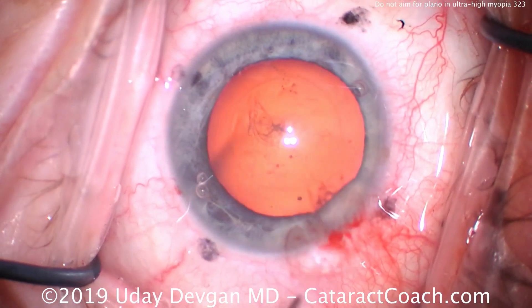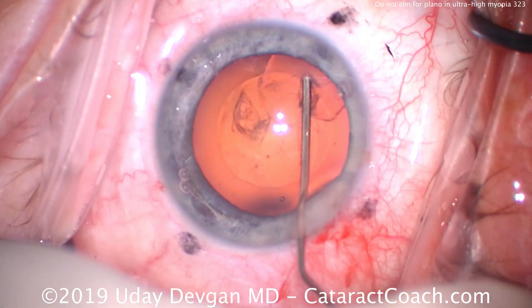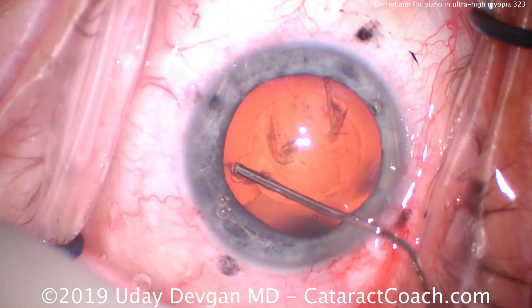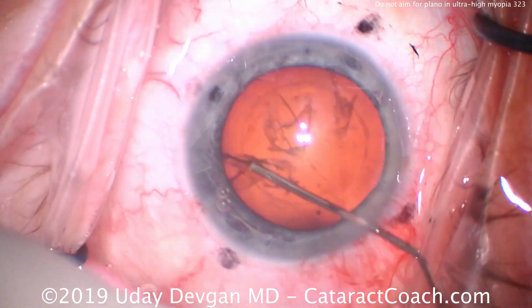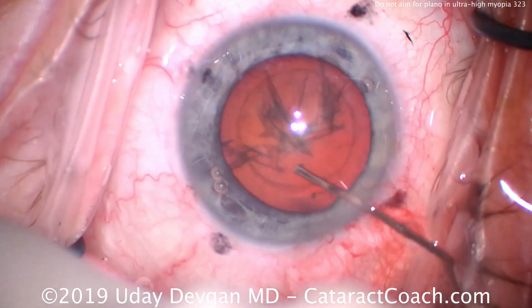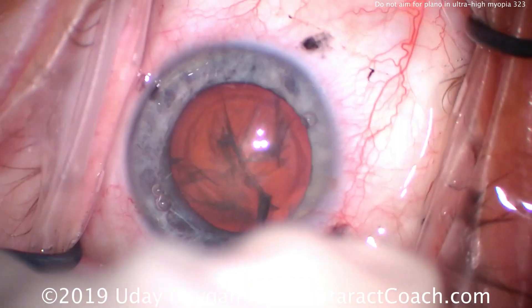To remove the cataract, we'll do some hydrodissection. We're going to use a chop technique, which is my go-to. The incision has been placed at the patient's steep axis — with the rule, maybe a little bit oblique — a steep axis of around 75 degrees.